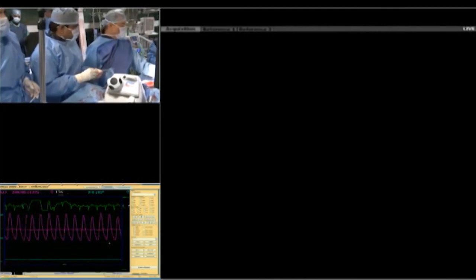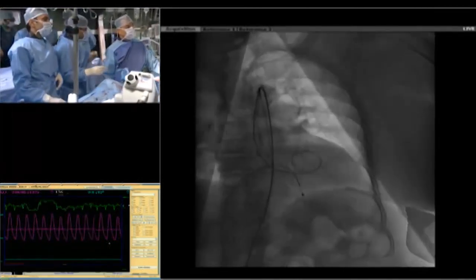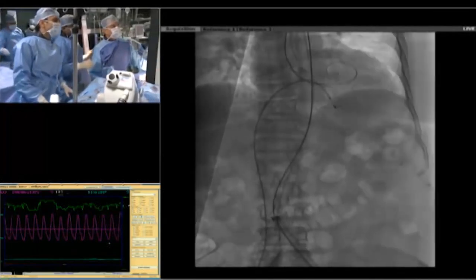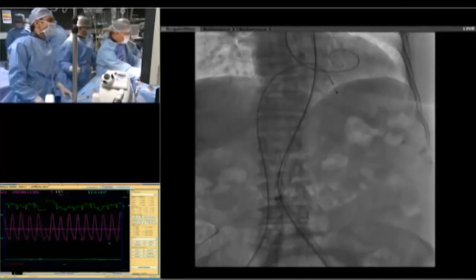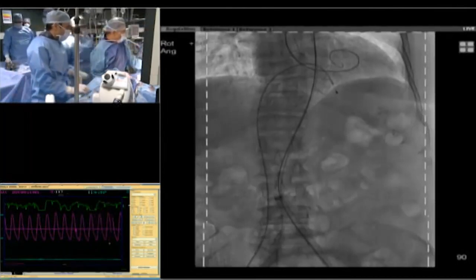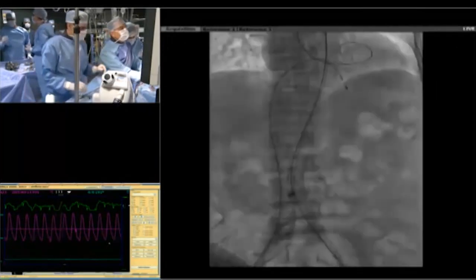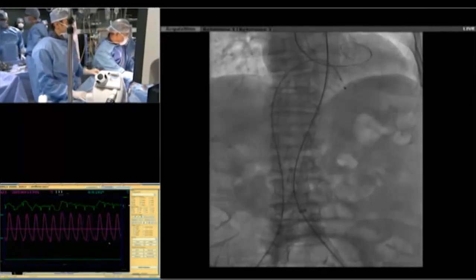So, Ravinder, we have a question here. I want to see both the places. How do you know that you've done an adequate pre-dil in these types of cases for a balloon expandable TAVR system? So what we did is we just used a 16 mm balloon. The idea to do a pre-dil is to make enough space so that the valve enters without much resistance.